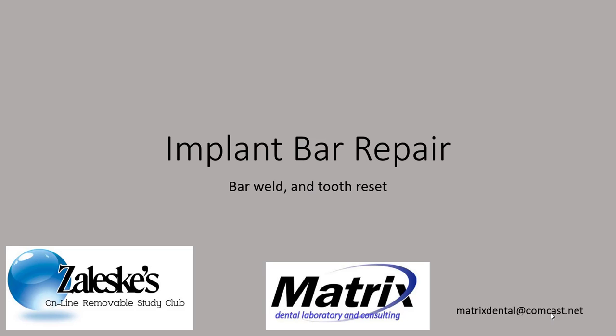So implant bar repair, bar weld, and tooth reset, a pretty basic one that comes along from time to time because basic rules of construction are ignored, and obviously at some place down the line we get a consequent failure. So I'm going to show you just a real quick one on how I attack the situation in the least labor-intensive fashion when presented with very few options, the few options being, of course, that they want to continue to use the bar that's fractured.